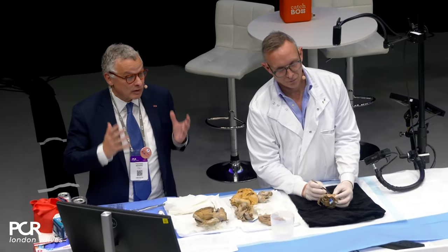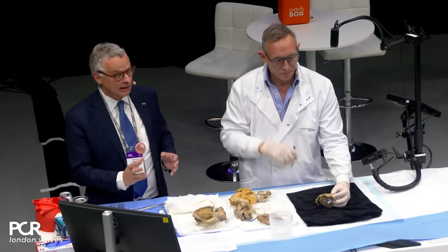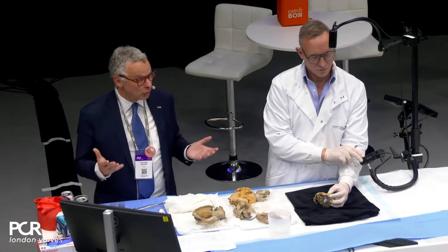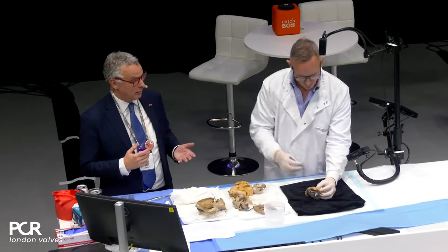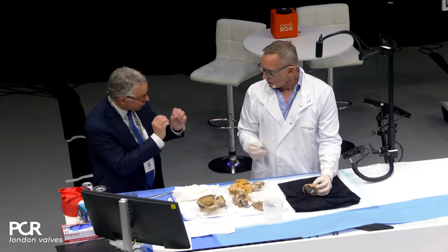So in the past, we were saying, okay, you go in the middle of the jet, grasp the leaflets, and it resulted often in a no-go. You were unable to grasp because there is not enough tissue, or we can even accentuate the MR because we create a lot of distortion. So it's very important to show really this thing.